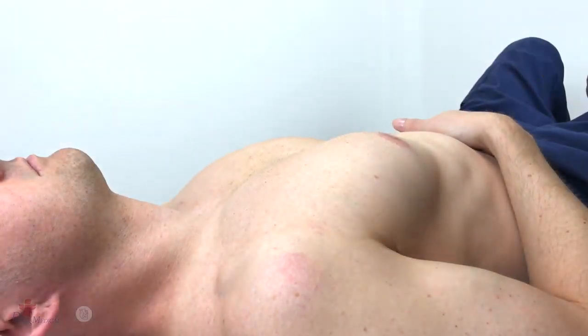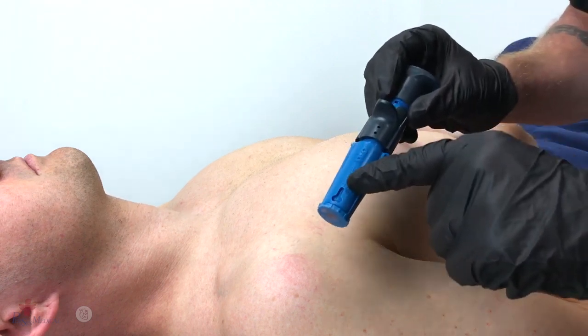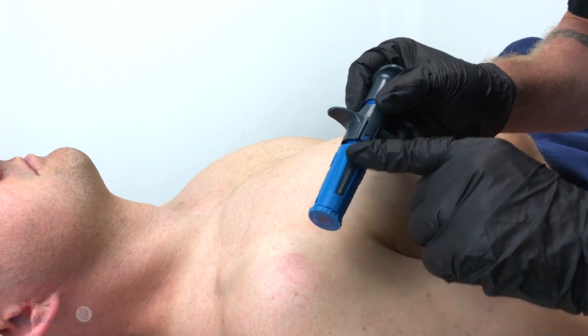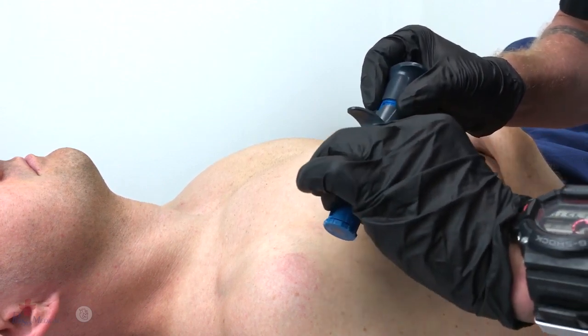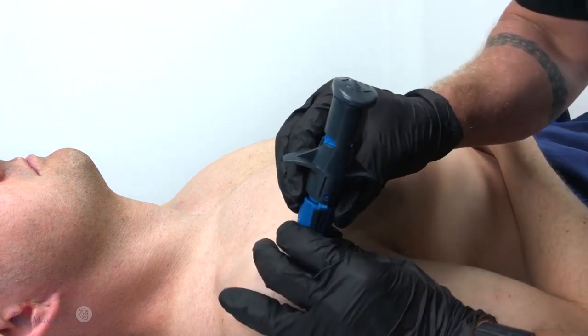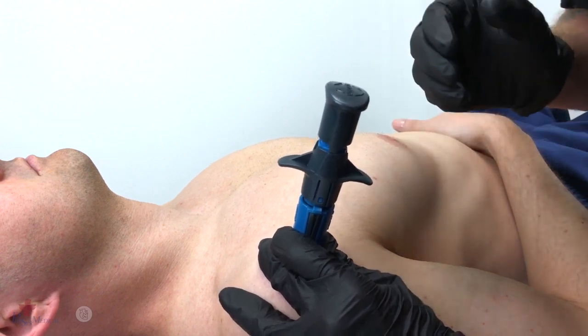Once the insertion site has been located and prepped, grasp the neo by the textured dots, taking care not to place a finger over the stabilizer locking tabs. Place the neo over the insertion site, utilizing the palm and fingers of that hand to stabilize the neo.